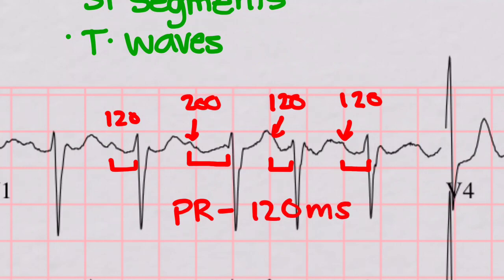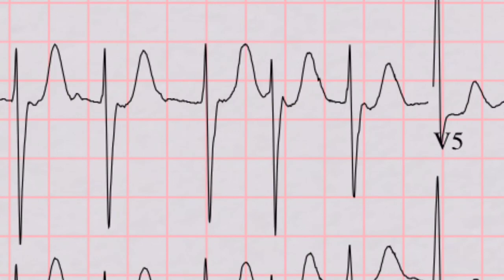Let's move down here now to some cleaner waveforms and do the QRS next. The QRS should be less than 120 we said, which is about three small boxes. I think that's about two and a half small boxes, so 2.5 is definitely less than that. So we would say that's about 100 milliseconds. Our QRS is A-OK as well.